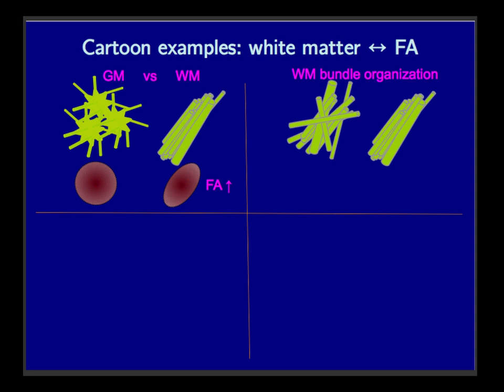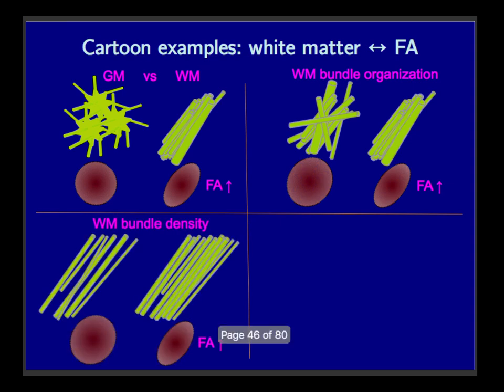Because what's the important property here? It's the differentialness of it. So jumbled white matter or nicely organized white matter, it's different. They're both white matter, but it's the jumbliness. So I would think that this one is roughly equally hard to move in any given direction, whereas here it's not. So the type of tissue may not really matter. It's the property of ease of motion.